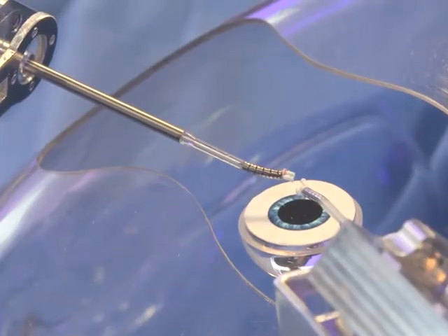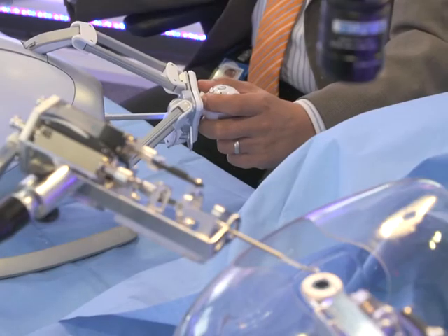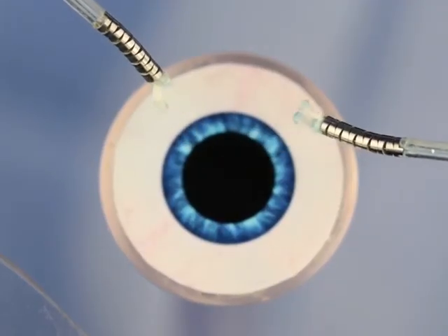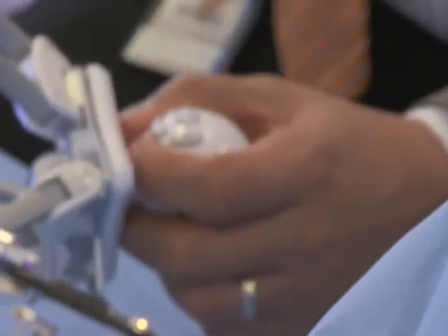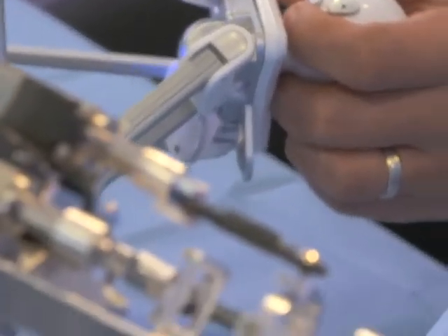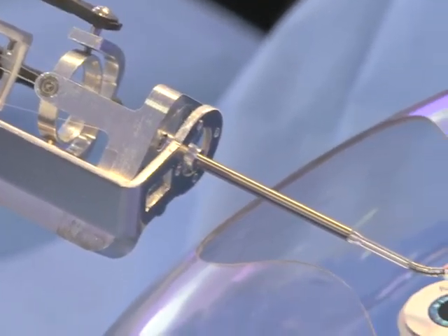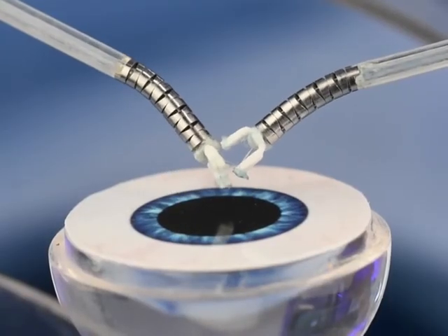So what we designed was a parallel manipulator. Instead of having motor, link, we have all of our motors attached to the base, and then we make up for that using a lightweight transmission. We use cable drives, which is a common design approach for parts of the tools in current surgical robotics, to go up the tool and provide the articulation. That way, no motor is carrying the weight of any other motor, and so you don't need as large of actuators. So that's one thing that we've done here.